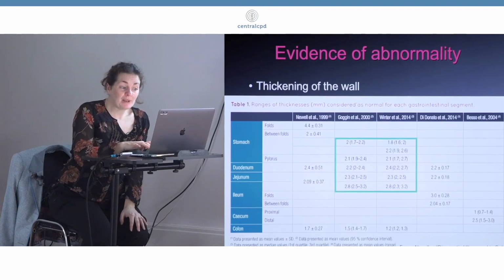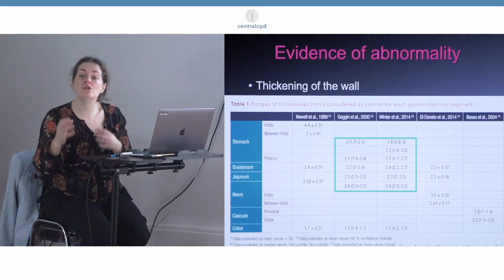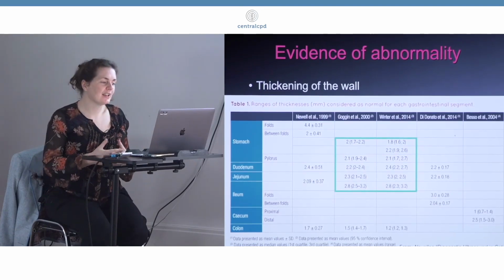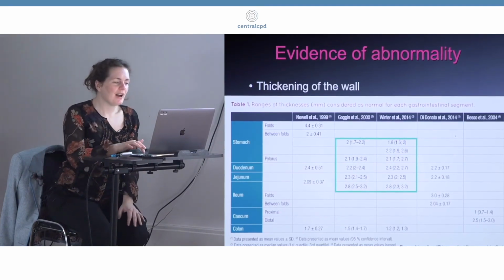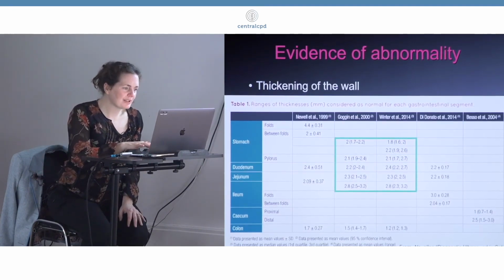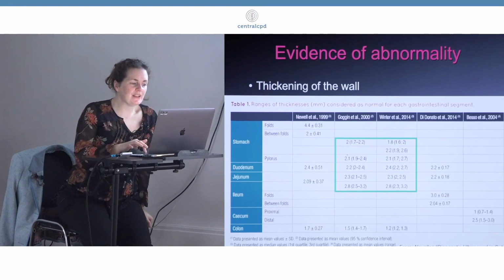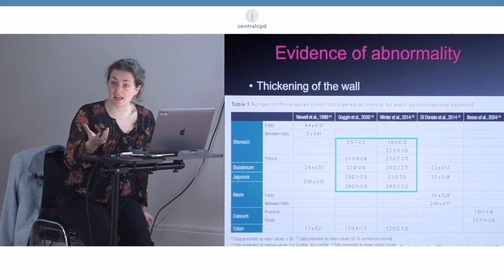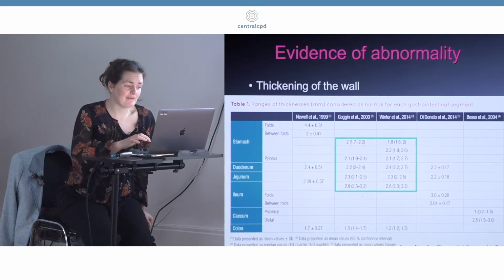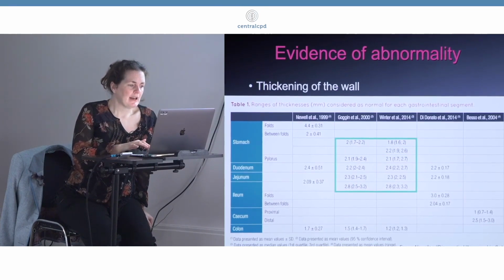So, people have published, as you can see over the decades, a whole bunch of different normal cats, and you'll notice that all the ranges are very slightly variable. I've put a little box around these middle two, and I've also put that into your notes so you don't have to frantically scribble any of this down. This is actually taken from the One Feline Ultrasound textbook, which I think if you guys are scanning a lot of cats is a good investment, because it does cover a lot of detail. It's a really detailed book.